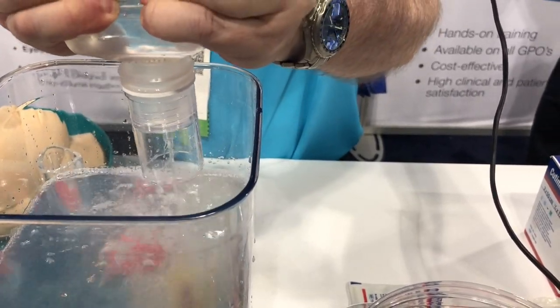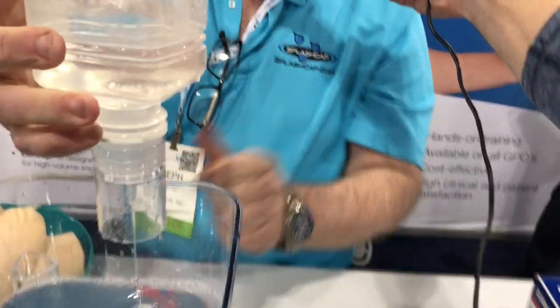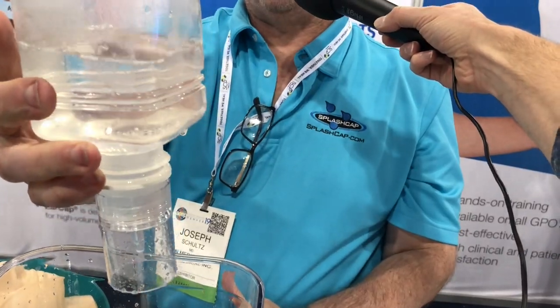I started off with that bottle full. You can see — boom — that's almost the whole bottle, that's two-thirds of the bottle in just a few seconds.